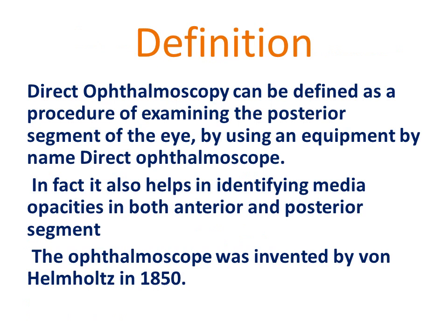Definition. The definition of direct ophthalmoscopy should be read like this. Direct ophthalmoscopy can be defined as a procedure of examining the posterior segment of the eye by using an equipment by the name direct ophthalmoscope.